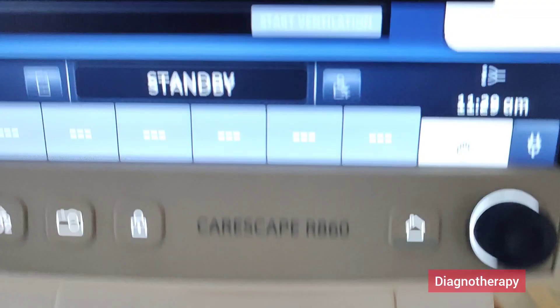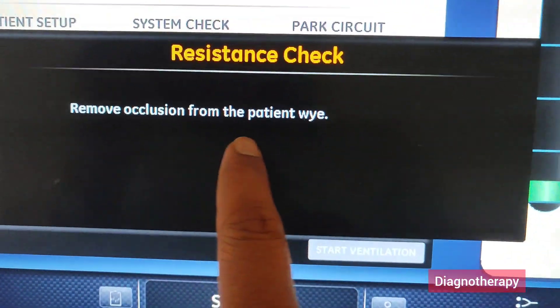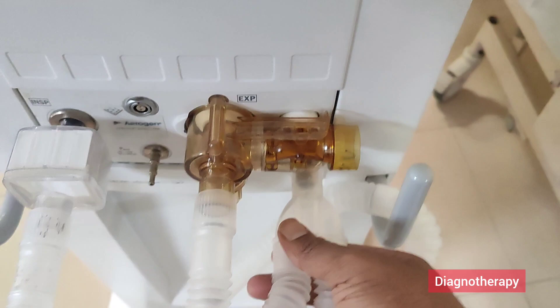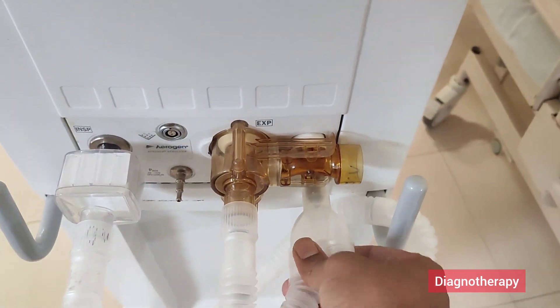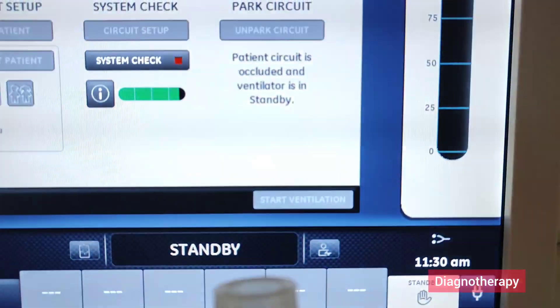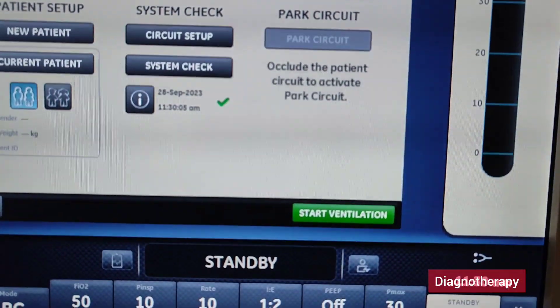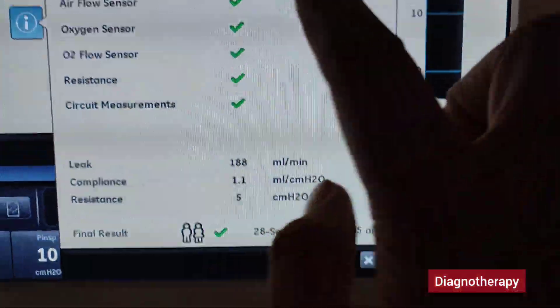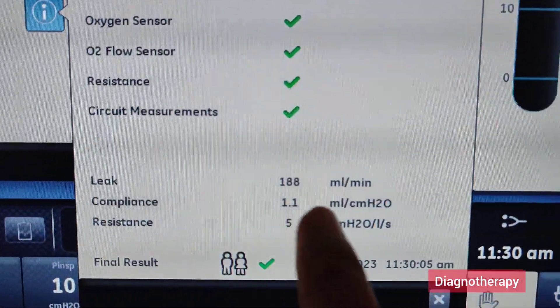Then the O2 flow is checked. Then it will prompt you to remove the occlusion from the patient Y. So we remove this occlusion and let it go to the air. After that, when we press the I button, the system check is complete. It will show the leak, compliance, resistance, circuit measurements and the final result.